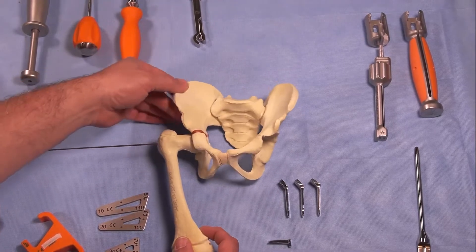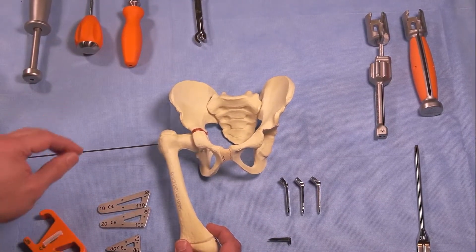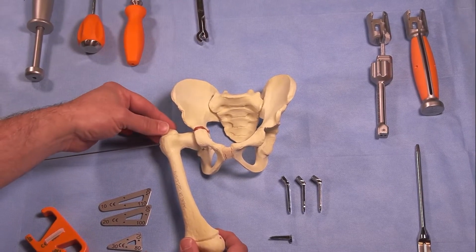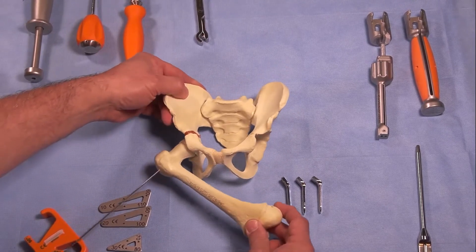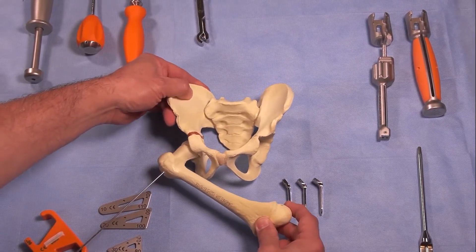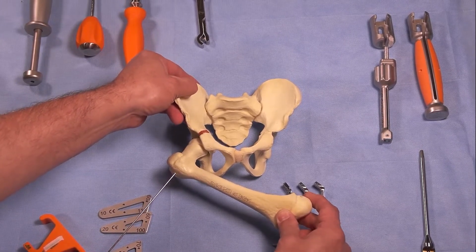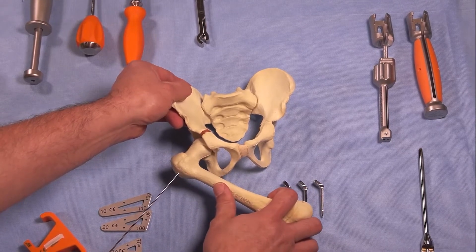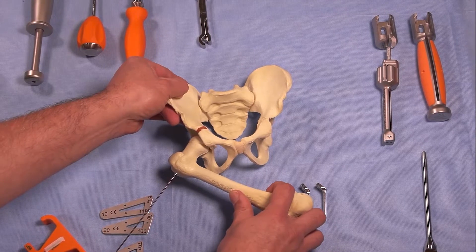You start the case by first completing the soft tissue approach — what we call the super hip. Once you've finished the soft tissue approach, you really want to make sure you can take the child's leg and place that femur into the corrected position. If you imagine the shaft being translated back into the right position, that gives you a neck shaft angle of approximately 130 degrees, and that's what we're going to try to achieve.